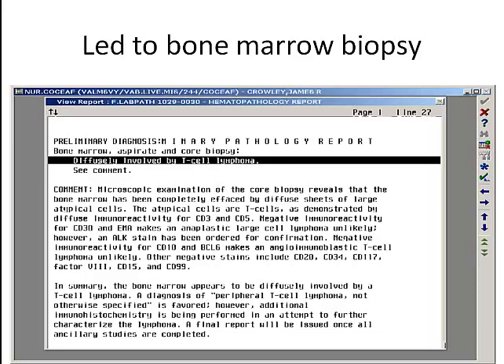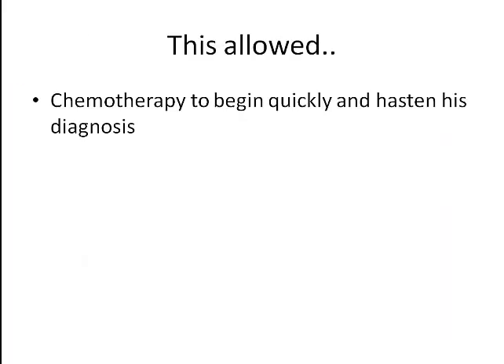So I found this patient really interesting. One of my technologists brought this patient to me and worked it up as a case study to add to this type of talk. And that moved the patient out of worrying about the sarcoidosis and into worrying about his cancer. And just as an interesting note, when we go back and look at all of our infection PET scanning, we're finding cancer a little less than 10% of the time. Cancer comes in with fever. Cancer can cause weight loss, malaise, all of these things.